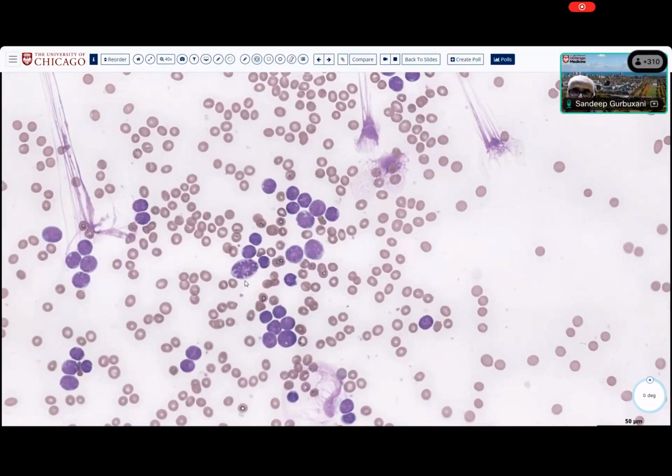We do have a mitotic figure in the field, which in the bone marrow doesn't mean a lot. But in this case, where you have no normal hematopoietic elements, you have cells that all look very similar to each other. We're dealing with an abnormal condition because the cytoplasm is not blue, the nuclei are not very prominent. I don't think these are erythroid precursors. And there's a lot of traffic in the chat that implies that these are blasts, which is correct.